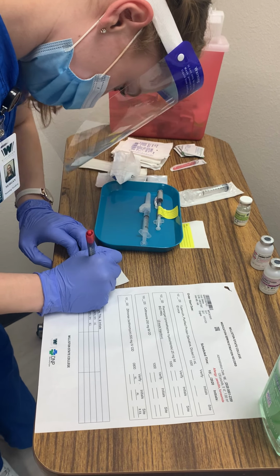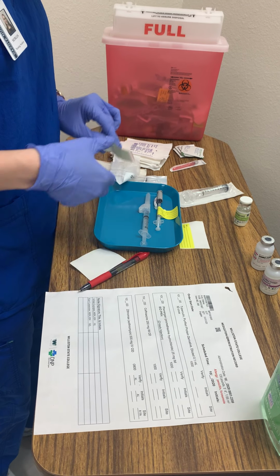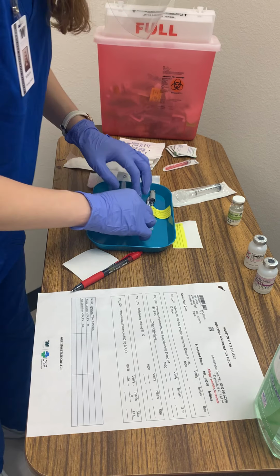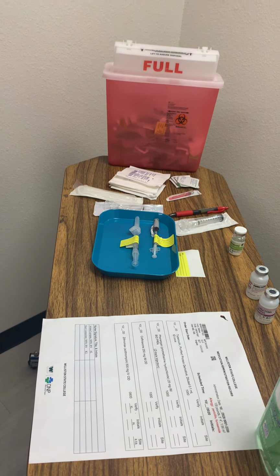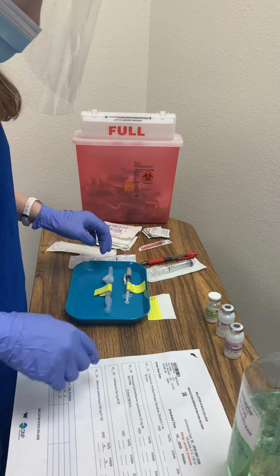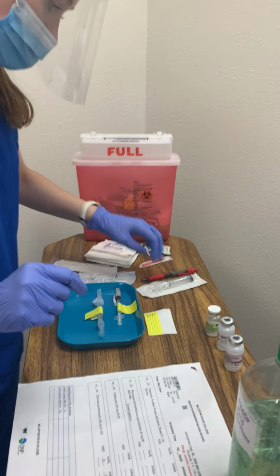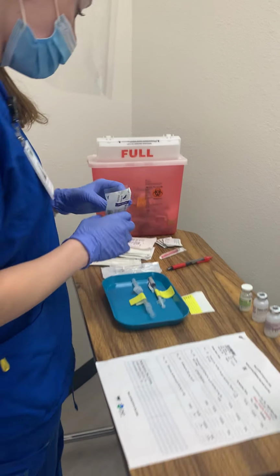Time, 49, perfect. So I'm gonna put that on there. Okay. So let me just get rid of my garbage. And so lastly, I'm going to be doing my ceftriaxone. So I'm not actually going to be administering this just for video purposes. I'm going to be showing you how to reconstitute a medication.